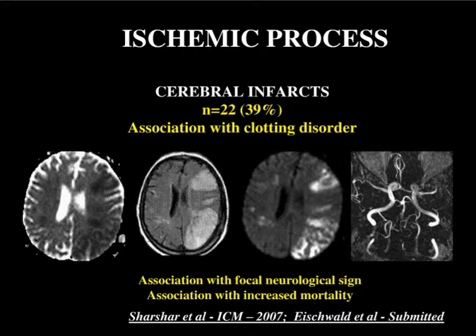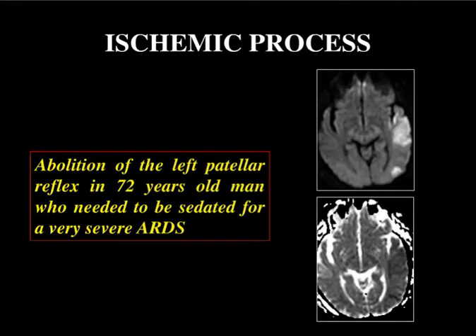It was most often revealed by a focal neurological sign. And you know that you can evoke, for instance, a stroke by doing a simple neurological assessment, such as evaluating the tendon reflex. Here, this patient had an abnormal left patellar reflex. We did an MRI.